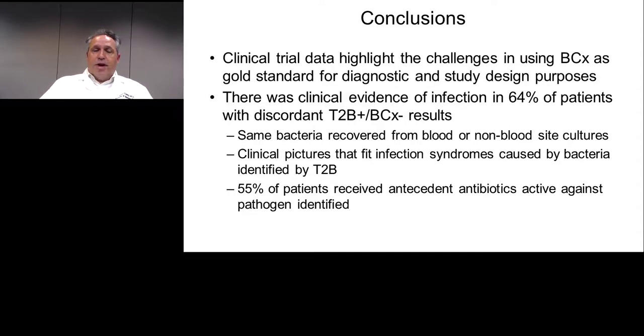So I think the clinical trial data for both Candida and bacteria highlight the challenges in using blood culture as a gold standard. In fact, with T2 bacteria, we found there was clinical evidence of infection in 64% of patients who had T2 bacteria positive, blood culture negative results, and that in 55% of patients, antecedent antibiotics active against the bacteria that was identified were being administered.